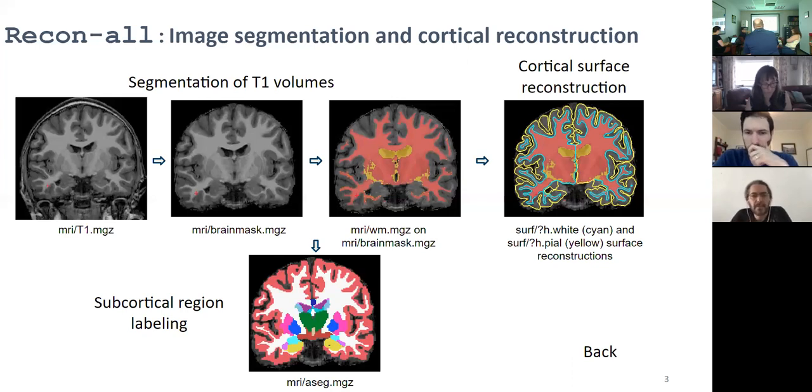And also another question for the structural acquisition parameters. Are there any recommendations as to what's the best quality T1 weighted image that you can get for FreeSurfer to run optimally, or do they not care? They just use anything? No, they do. MGH's protocol is actually fairly old now, and each time we've started a new study, I've asked if there's an update, and there hasn't really been. The only updates have been in the speed of the acquisition, but there's a multi-echo MPRAGE acquisition at MGH that's recommended.